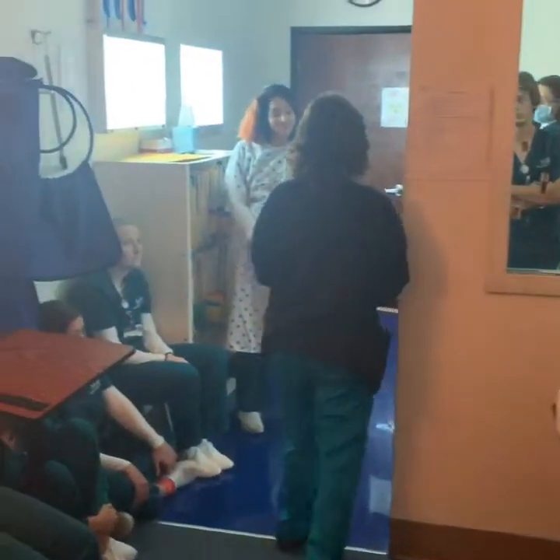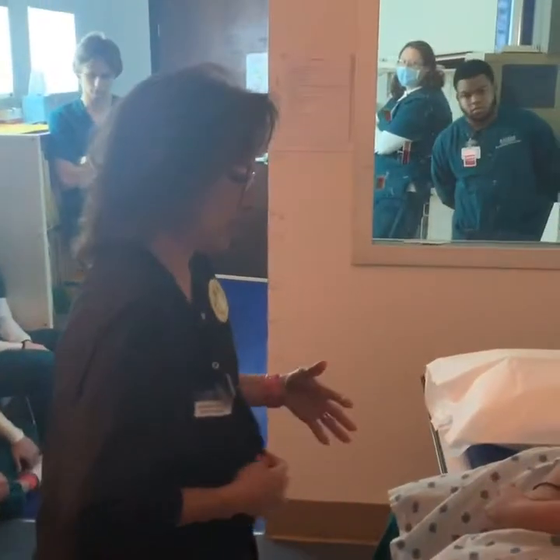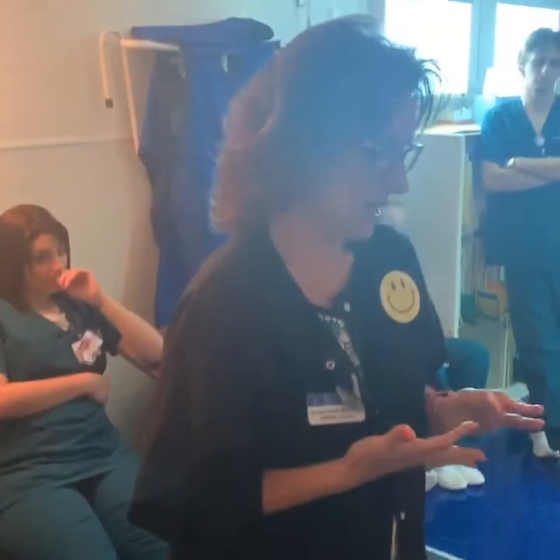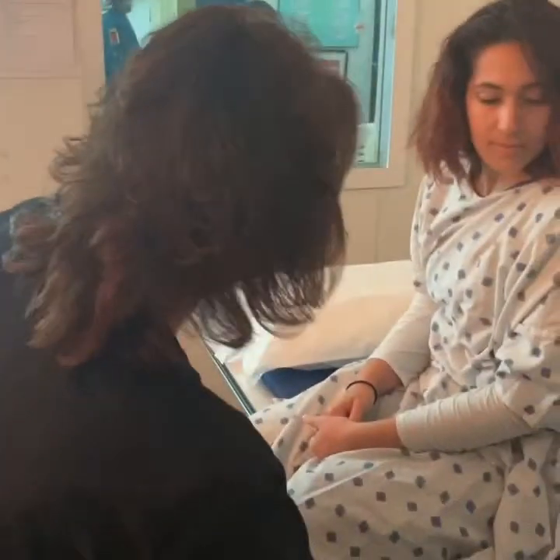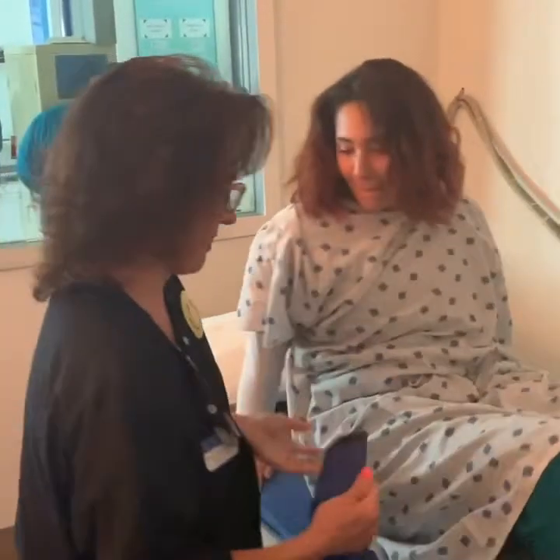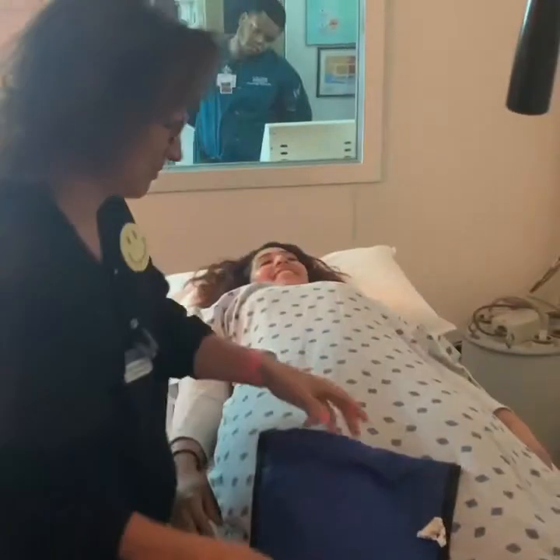All right, y'all set? Come on in here. We'll let you have a seat on the edge of the table there. And we're just gonna go with history that we've asked her what she did, localize the area of injury, confirm that there was no previous surgery with that, kind of get all of those questions answered. We won't go through that on the video, we just know that we have done that. So we'll let you go ahead and lie back on your back. We know that there's no chance she's pregnant, because I should have asked that while she was out there. That's what I blanked on.